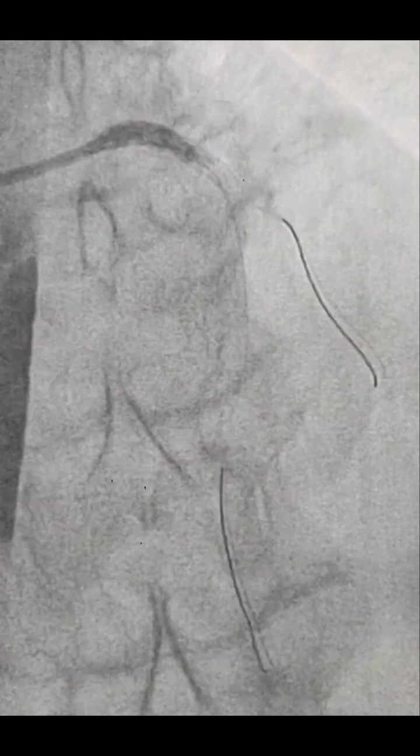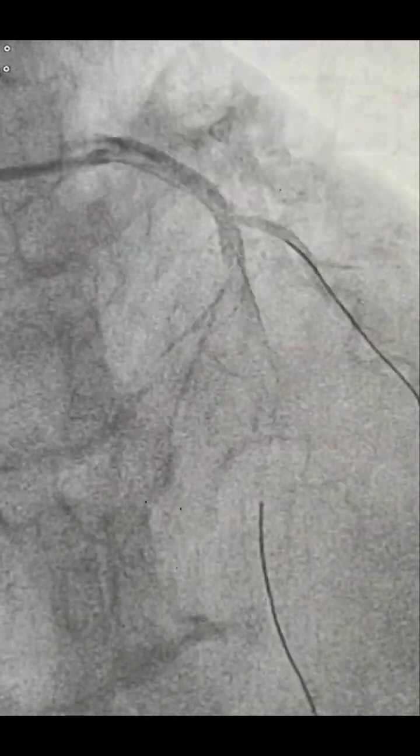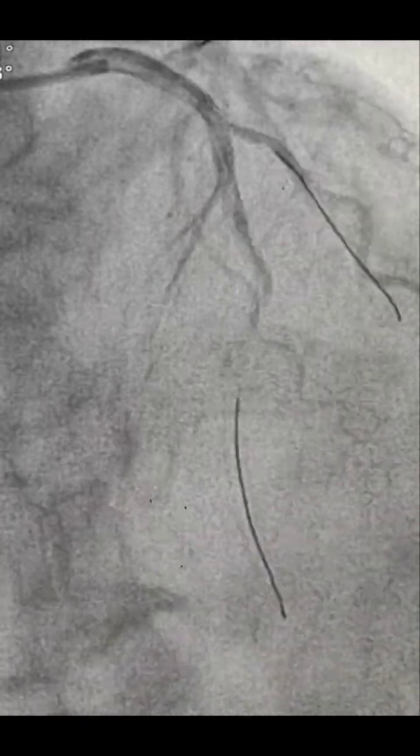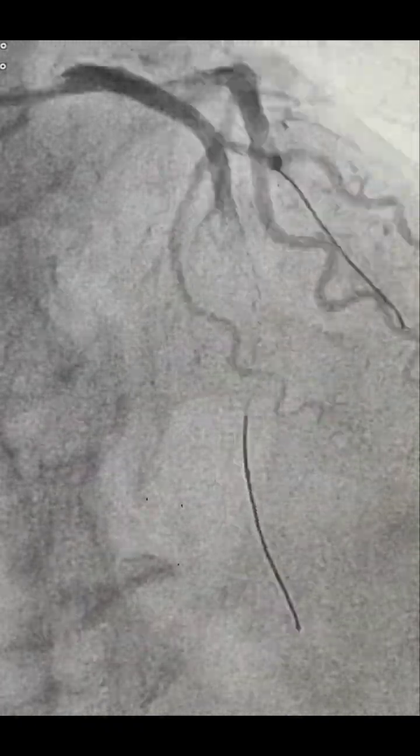So at this point of time, I proceeded with the thrombus aspiration, and I aspirated the thrombus. There was very minimal thrombus which I could aspirate. So after thrombus aspiration, this was the cine, and you can see some improvement in the flow. Diagonal was okay, same as earlier.